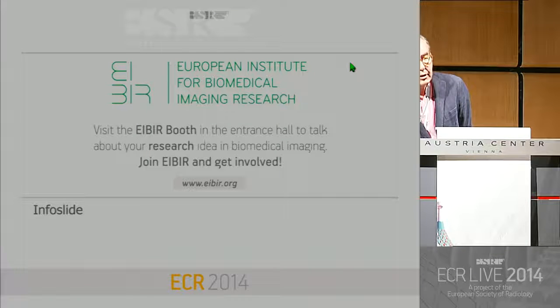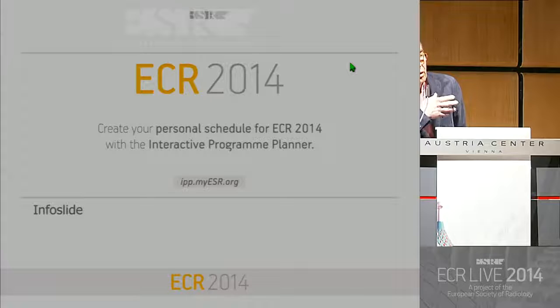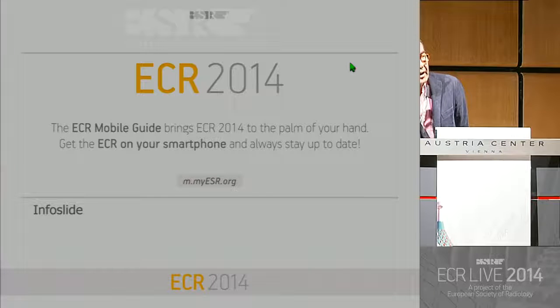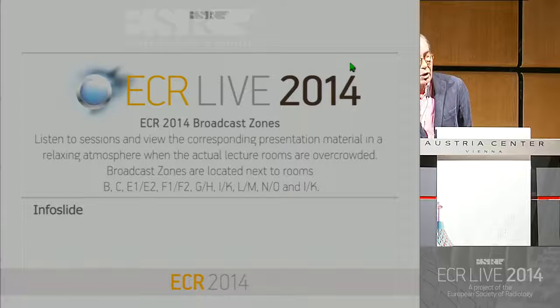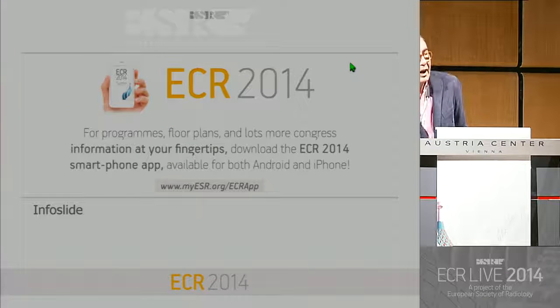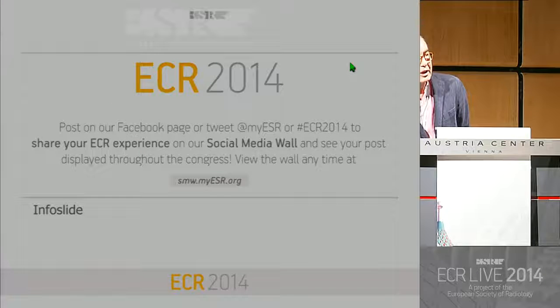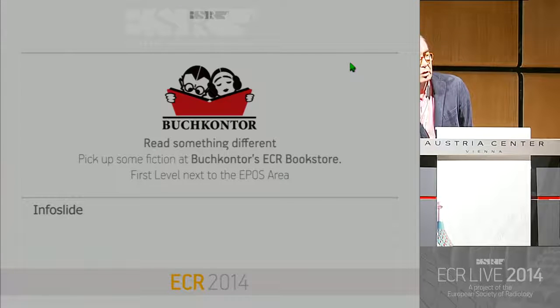This is considered as a score 4 at the moment, but most of these score 4 have been based on evaluation with a B value not higher than 800. I think that should be evaluated again, because what's dark on ADC and isointense at B2000 is not really very suspicious. That's what I think. But again, I'm careful, and this is what we're going to do in the forthcoming weeks, because we have a meeting shortly to decide.